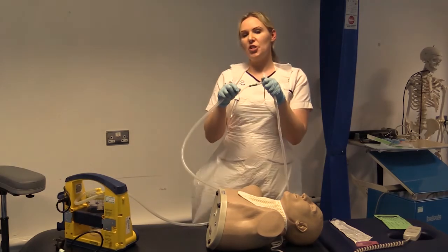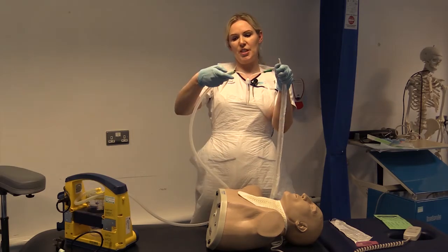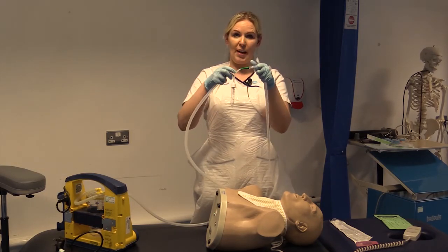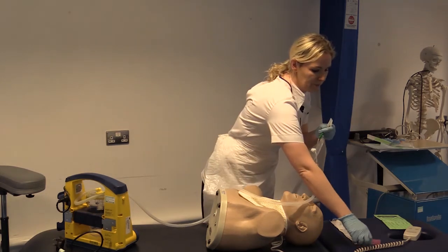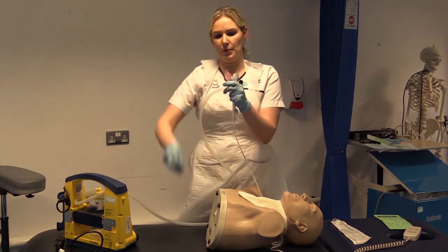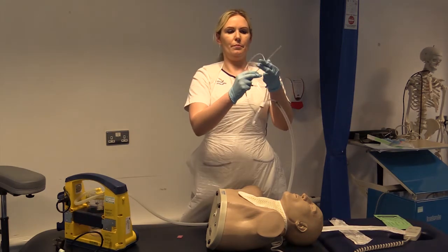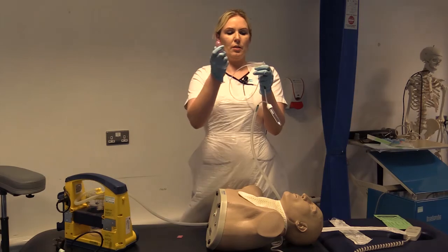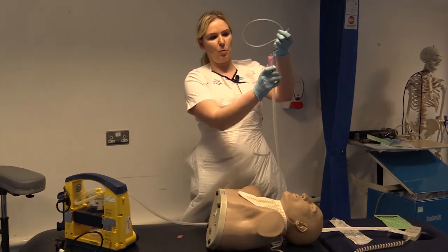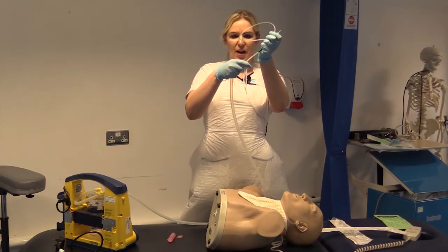Okay, so if after your suction's complete there's no secretions in your sputum trap, and there's secretions in the tubing or in the catheter, you're going to want to mobilize that with some sodium chloride. Okay, so what you do, you just open the top of your plastic vial. Okay, and with your suction, you're going to entrain a small amount of that into your catheter, and that should mobilize the secretions into the trap there. Okay. Once you've got secretions in the trap, then you can finish your suction.